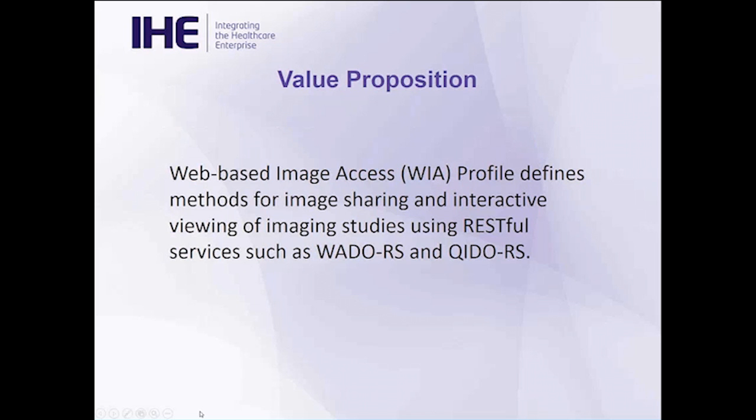So for this profile, the value proposition is that it defines methods for image sharing and interactive viewing of imaging studies using RESTful services. The key ones that we're using here are WADO-RS and QIDO-RS. Those are the new services that are provided by DICOMweb. And the key thing here, as I mentioned earlier, is support for image sharing and interactive viewing using RESTful services.